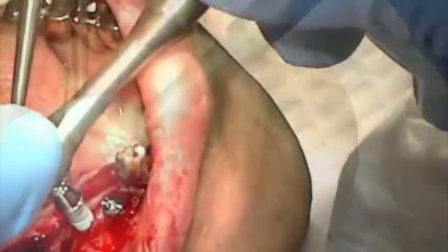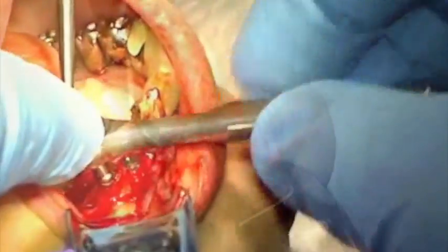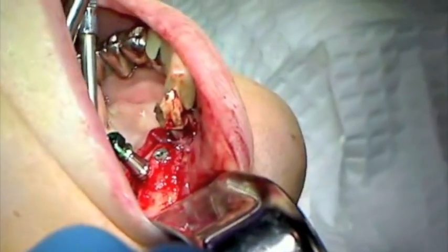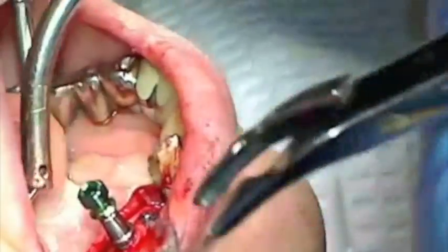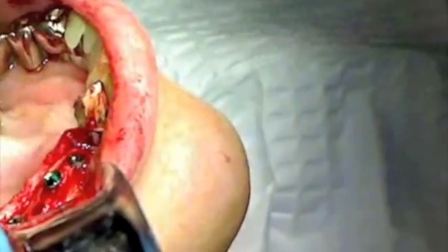The transfer abutment is color coded for identification. There is a universal square that allows you to transfer with either the hex driver, as seen in this video, or with a slow speed handpiece. Torque resistance should increase to final seating to assure initial stabilization during fixture placement. The transfer abutment should be placed in hydrogen peroxide and then back into the vial that the implant came in, in the event that you choose to use this abutment for restorative purpose.